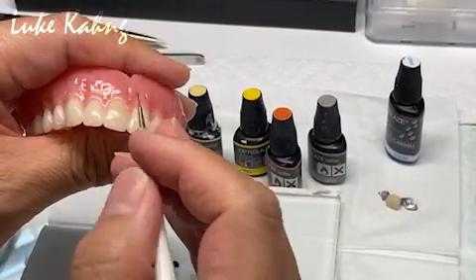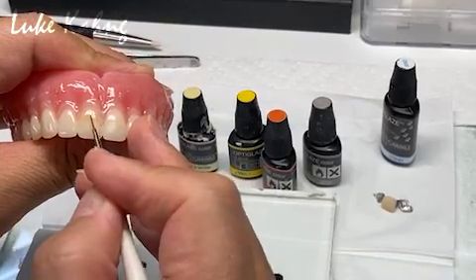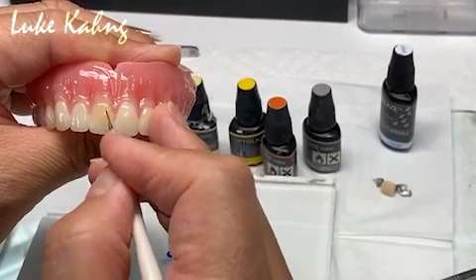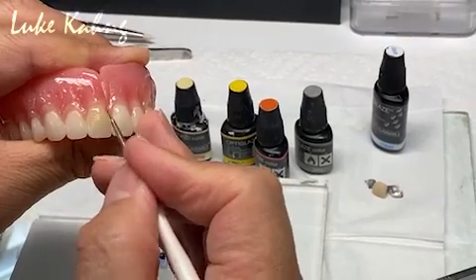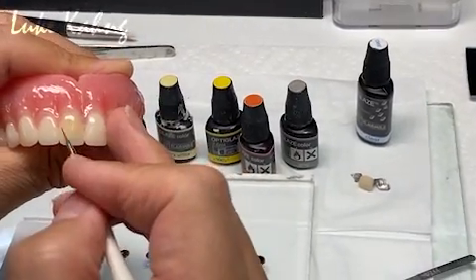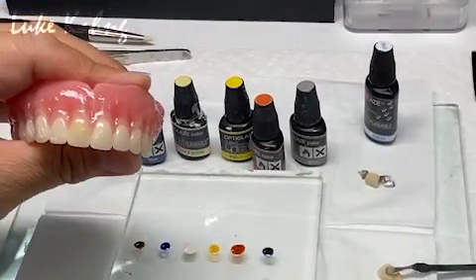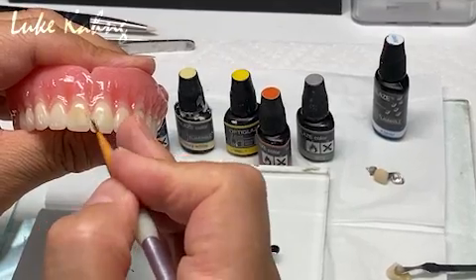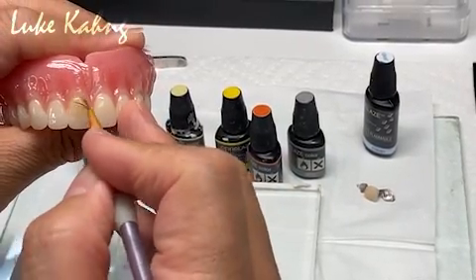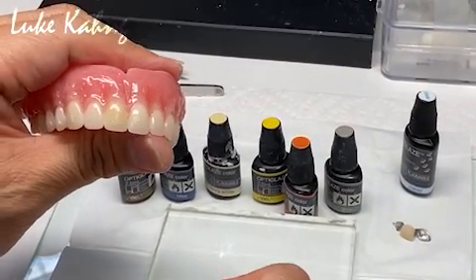Let's make it more darker, which is the D2. This material is very sensitive, so I have to do just light — all the way from the incisal one-third, so I make more enamel effect. So, like that D2, it's a little bit dark, so then just take it out. Okay.